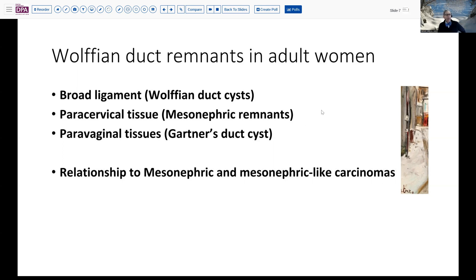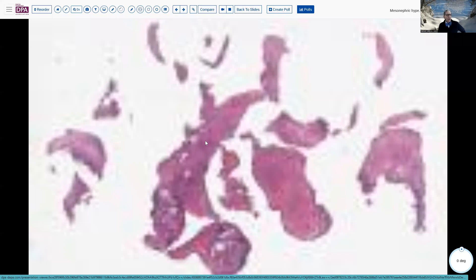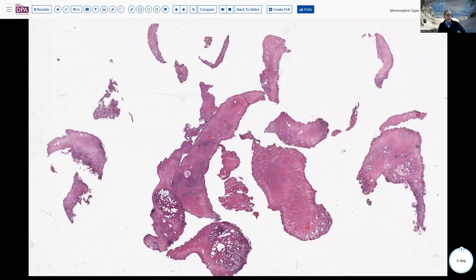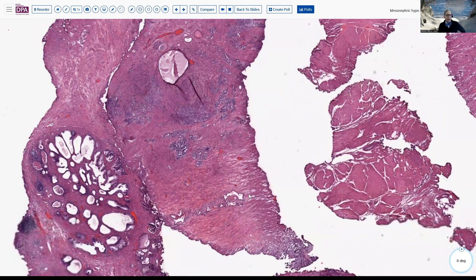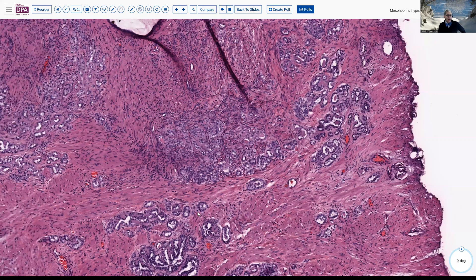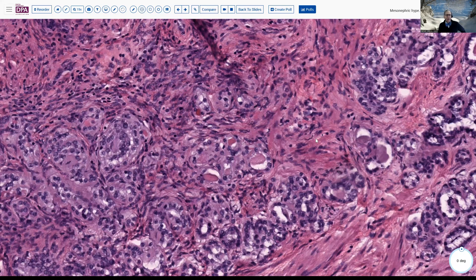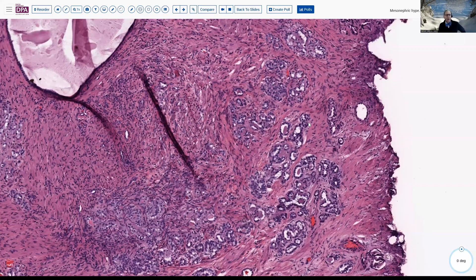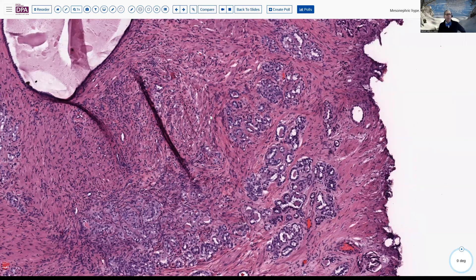We'll reference some related material in the links, but the purpose here is not to discuss the neoplastic component. Here's a nice example — actually from a prostatectomy specimen — that illustrates what these remnants can look like. Typically these are small clustered glands with a single cuboidal cell lining and often have a pink secretion in the lumen. Seeing something like this in paracervical tissue, one would readily recognize it as mesonephric remnants, usually at the 3 o'clock and 9 o'clock positions on that lateral aspect.